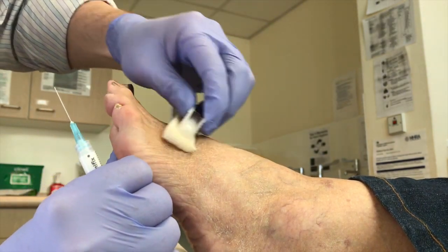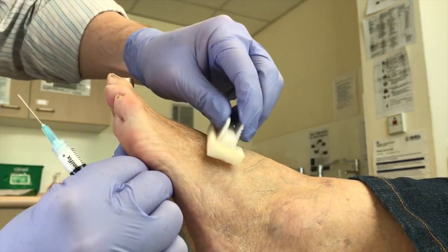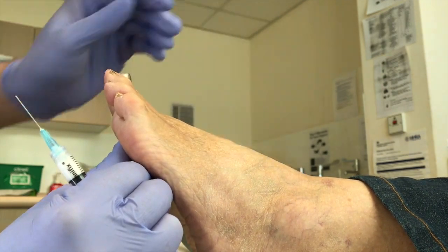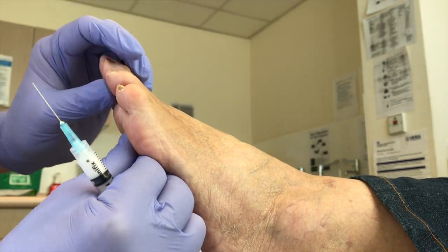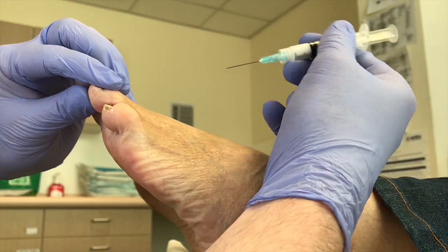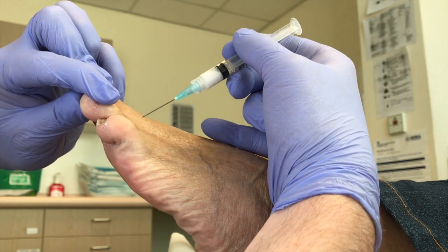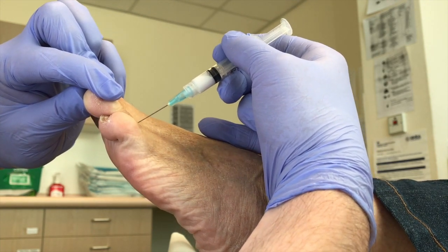Skin prep — these are the chloropreps that I like. A little bit of skin prep, very important. So let's look at our angle of the dangle. I'll try not to get my hand in the way. Okay Diane, little scratch. Three, two, one, scratch.